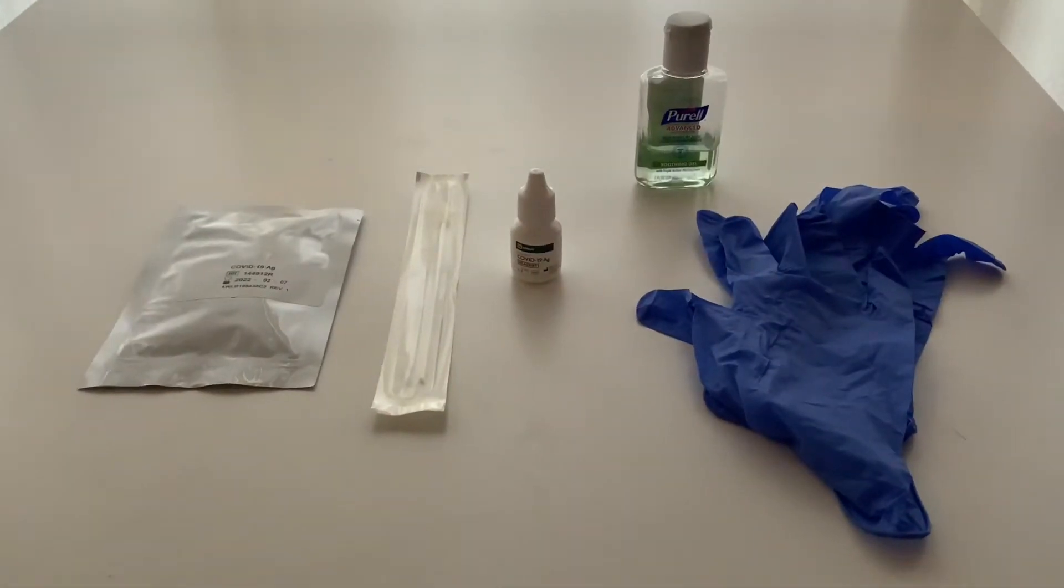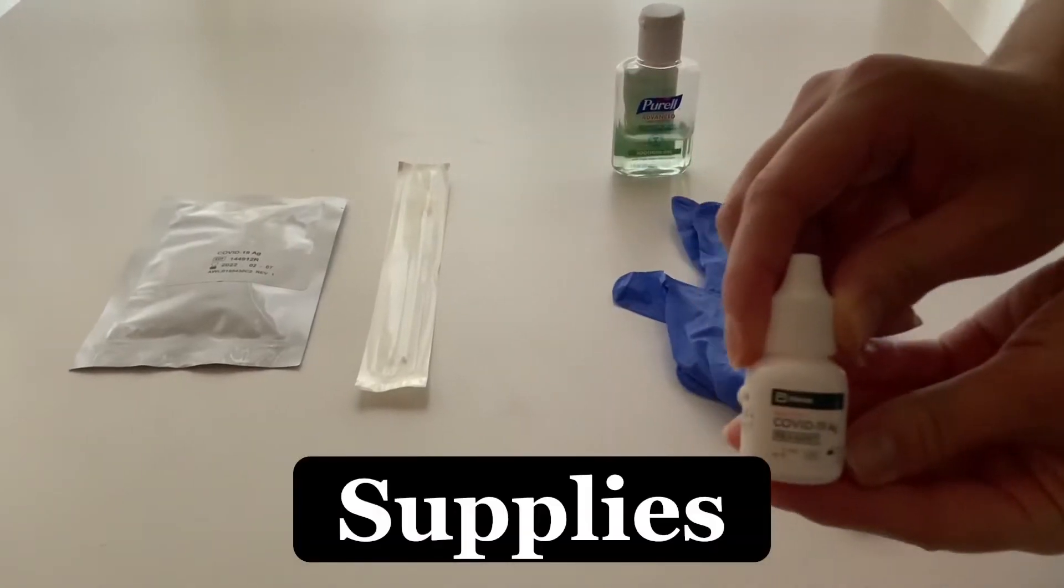Welcome back to R&Scrubs. Today we're going over the Abbott COVID-19 AG rapid test. This is a 15 minute test you can do at home.